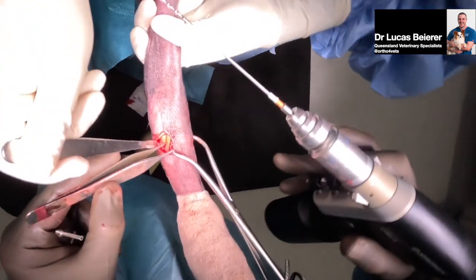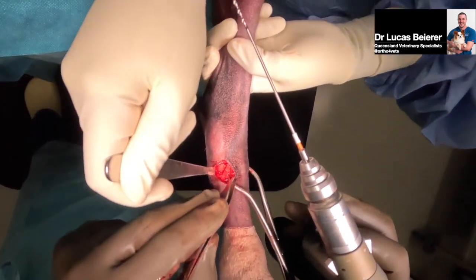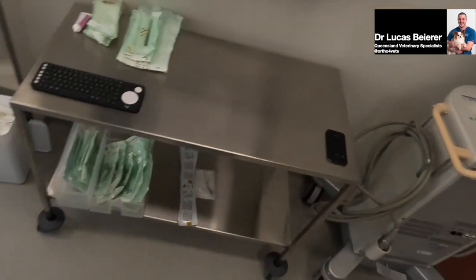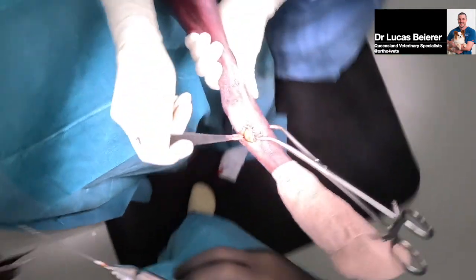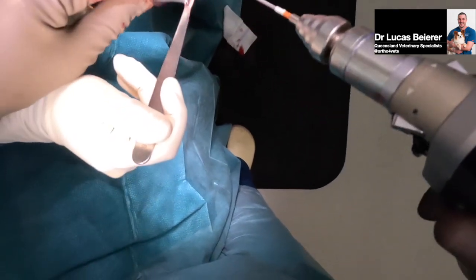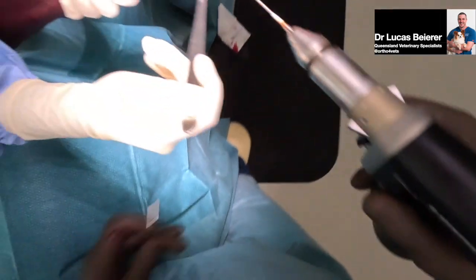So I'll just appreciate where our bone and joint is. And we'll go across the base while missing that screw.